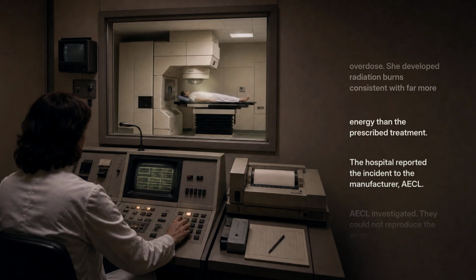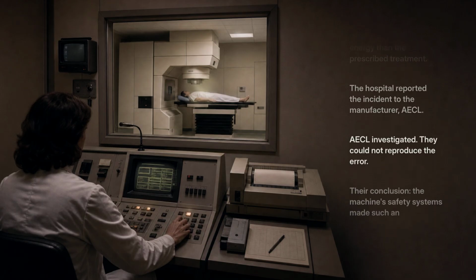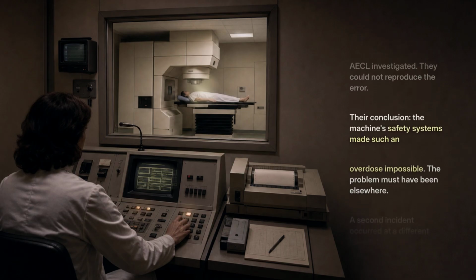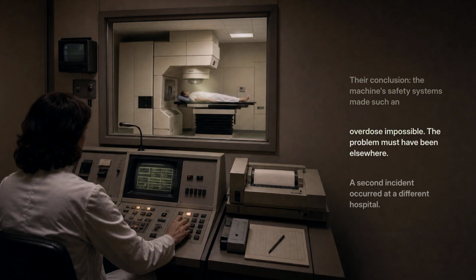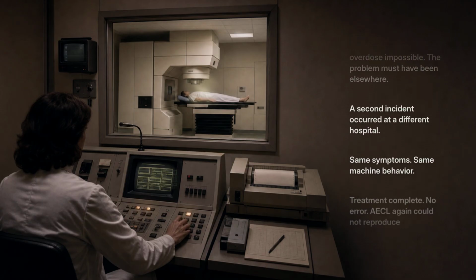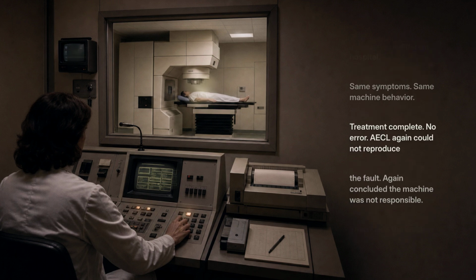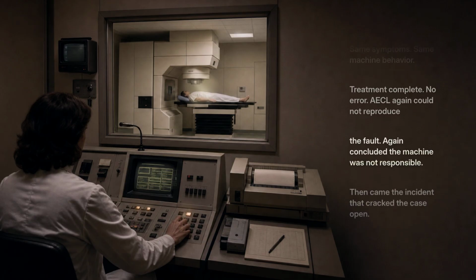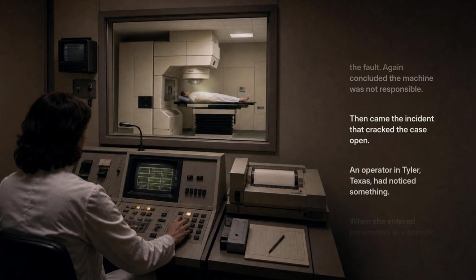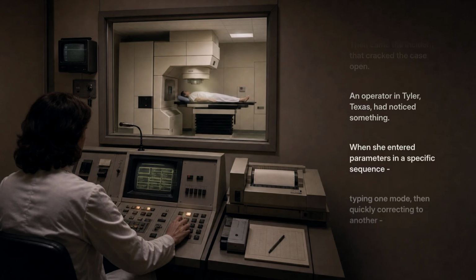She developed radiation burns consistent with far more energy than the prescribed treatment. The hospital reported the incident to the manufacturer, AECL. AECL investigated. They could not reproduce the error. Their conclusion: the machine's safety systems made such an overdose impossible. The problem must have been elsewhere. A second incident occurred at a different hospital. Same symptoms, same machine behavior, treatment complete. No error. AECL again could not reproduce the fault. Again concluded the machine was not responsible.